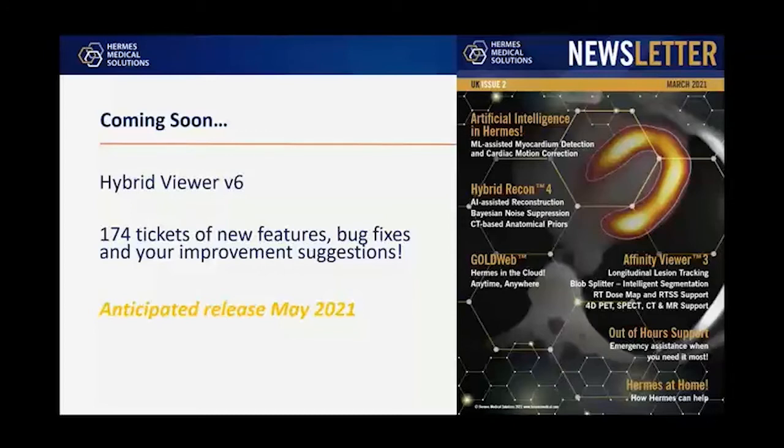Just to give you an update on release status, we're probably going to be looking at release around the end of next month. We are due to be starting the last round of testing this week, and then it will go through the whole quality control. If we find any bugs, they will be addressed, and then finally it will be officially released. But as Helena alluded to earlier in her presentations, it's quite a complicated process, and it's very regulated in terms of the release. So please bear with us, but it will be with you soon.